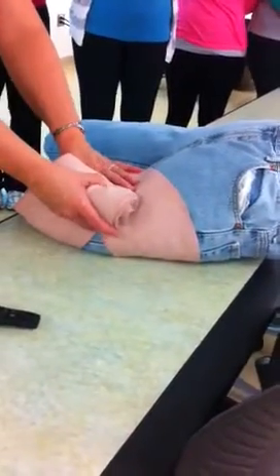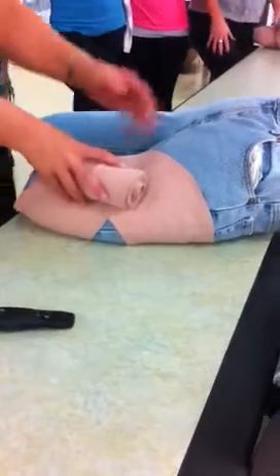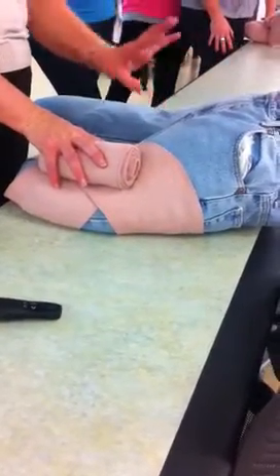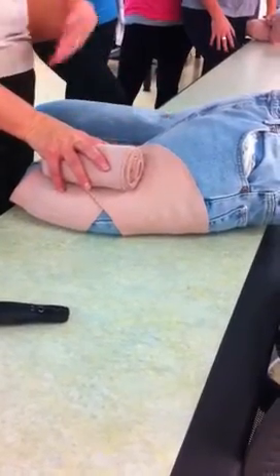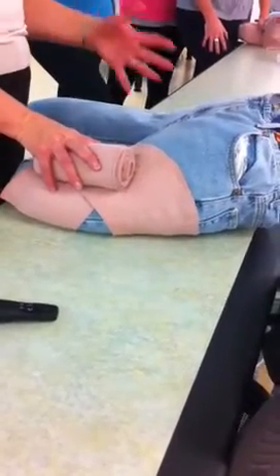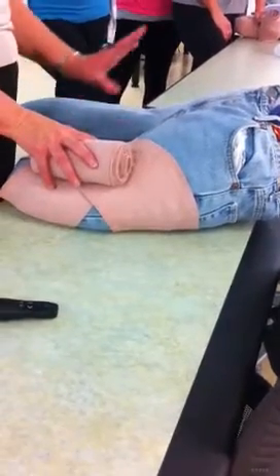Now, if you're working in an acute care hospital, which is generally where you're doing this kind of residual limb wrapping immediately after surgery, the person usually doesn't have jeans on, right? And depending on the gender, it really doesn't matter what gender, you want to protect modesty, okay? So that's where you hand them a towel and you say, please arrange this in such a way that I'm not going to embarrass you, that you've got all of your equipment out of the way.